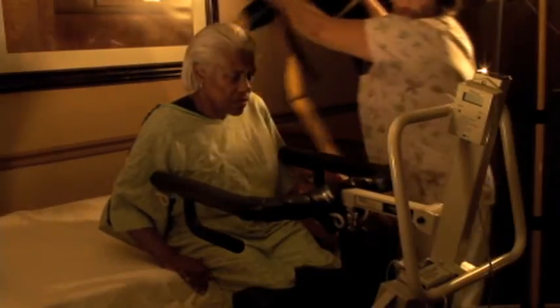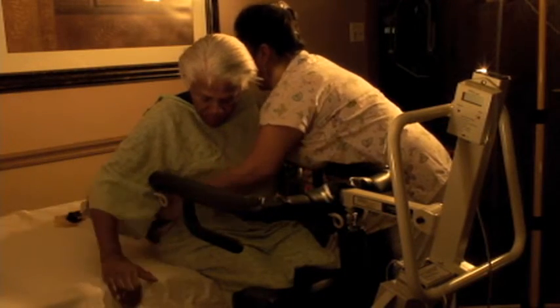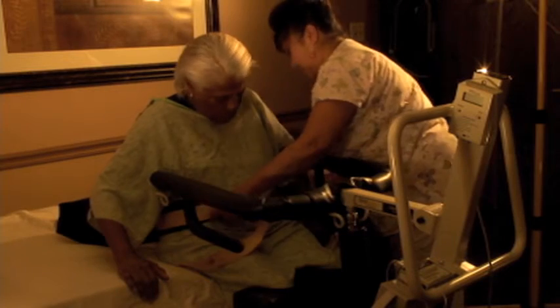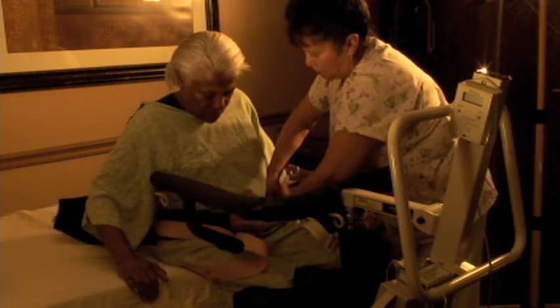Second, pull the lift up to the resident and lock the brakes. You don't want the lift sliding away from you while you are stabilizing the resident. Crank or lower the lift as far down as possible. Third, hook one side of the belt to the lift.